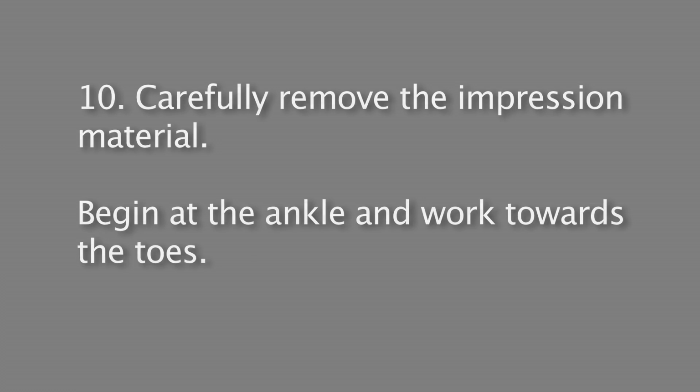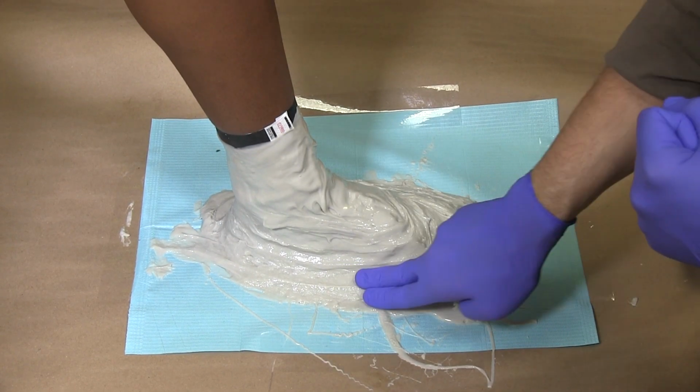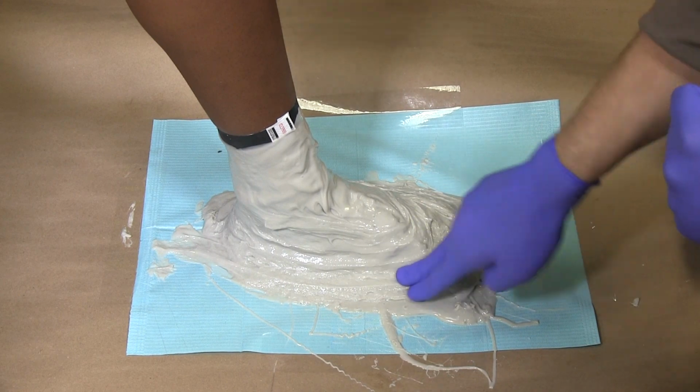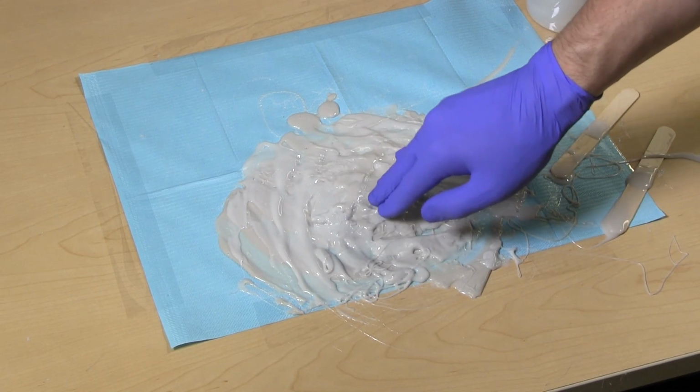Wait approximately 3 to 5 minutes for the impression to cure completely. When excess material on the work mat is cured, the impression is ready to be removed from the patient. If the material is tacky to the touch, wait a few more minutes.